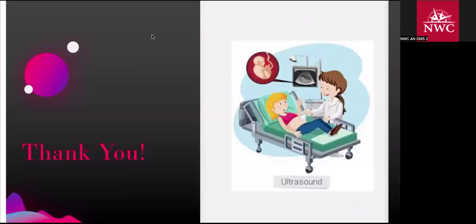Okay, and then you want to make sure you read the rest of the chapter, which talks about how to operate your ultrasound machine and then how to save and store. On page 39, they talk about the PACS, which stands for Picture Archiving and Communication System. It says, which is based on computer technology, it allows for improved image resolution as images are stored in a digital format. So PACS is what stores your images.